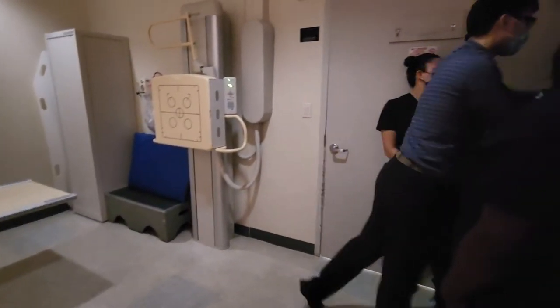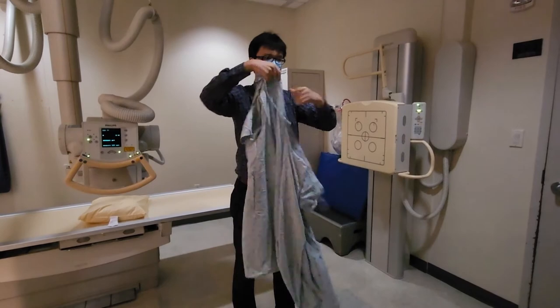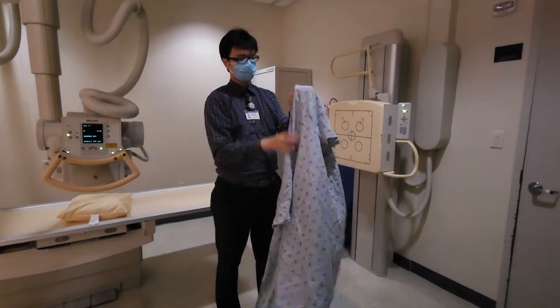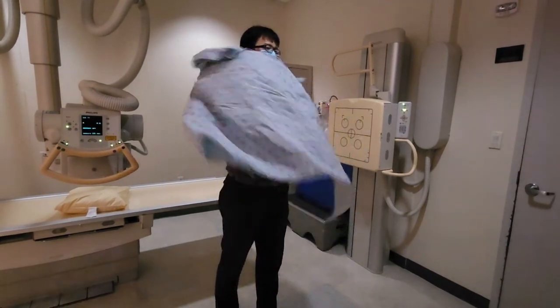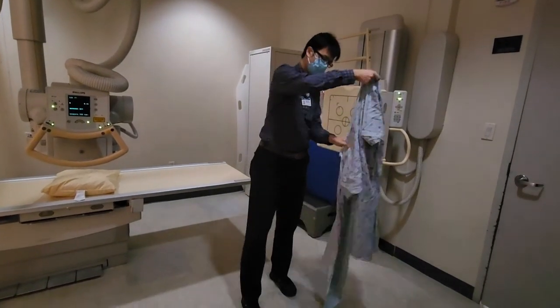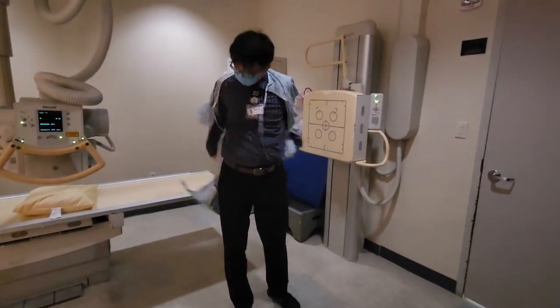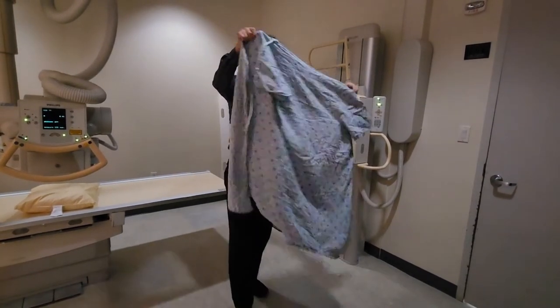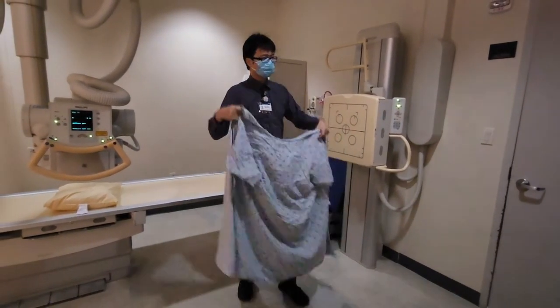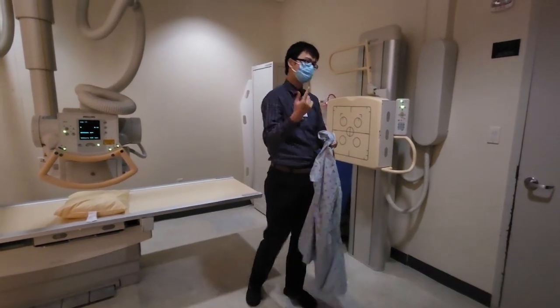Have the patient put on a hospital gown. Notice that it is completely cloth — no metal, no snaps, no zippers — so it will not show up on the x-ray. Patients should put this on open in the back. Because with no shirt and no bra, you don't want them walking around with it open in front. Some patients who are uncomfortable with a single gown: you can give them two — one open in the back, second one open in the front — so they are fully covered all the way around.